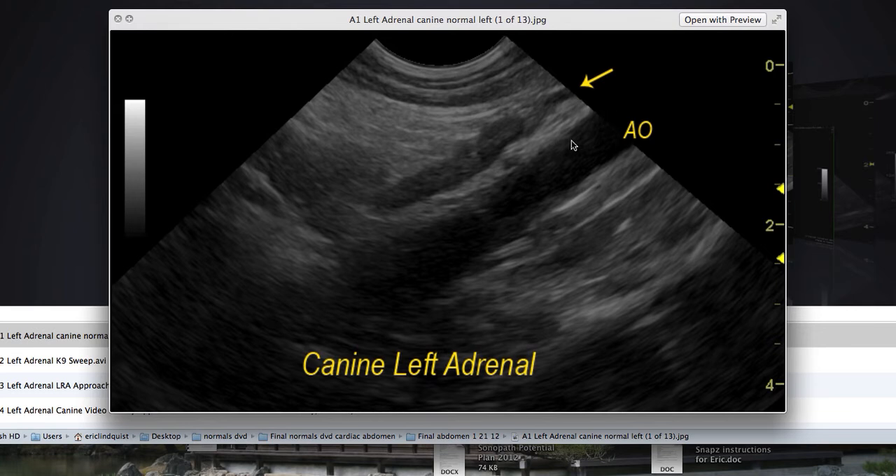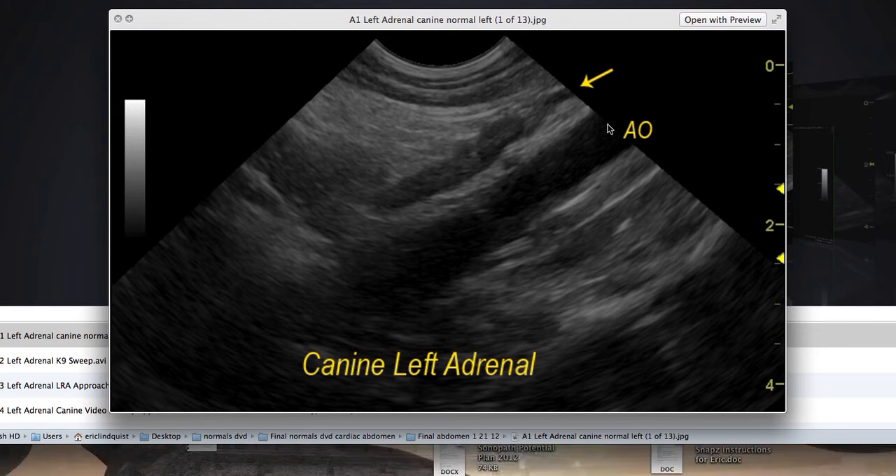The key is to find a nice long aorta on the sonogram. The way I do that is I minimize the real estate between the probe head and the target organ. In this case, I'm scanning this left adrenal gland at one centimeter. If you scan at a minimal distance, the resolution of the structure will be improved greatly — you can make a $40,000 ultrasound machine scan like a $100,000 one. But if you're scanning at five or six centimeters, the resolution is not going to be very clear. This is one of the reasons why people miss adrenal glands so readily — they scan at too far a distance.